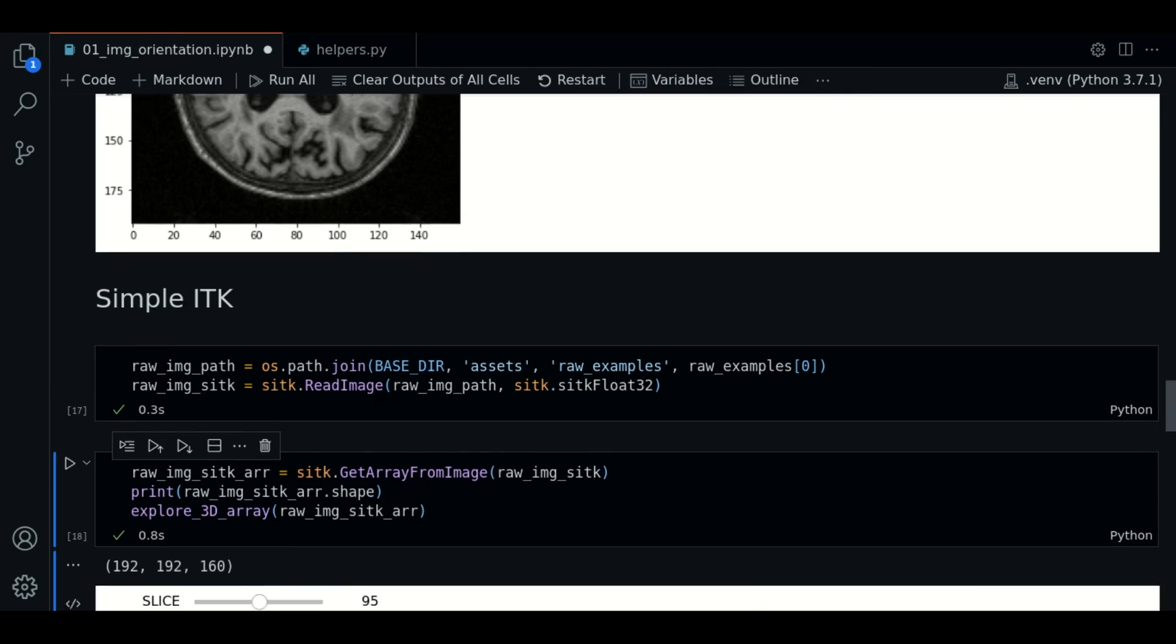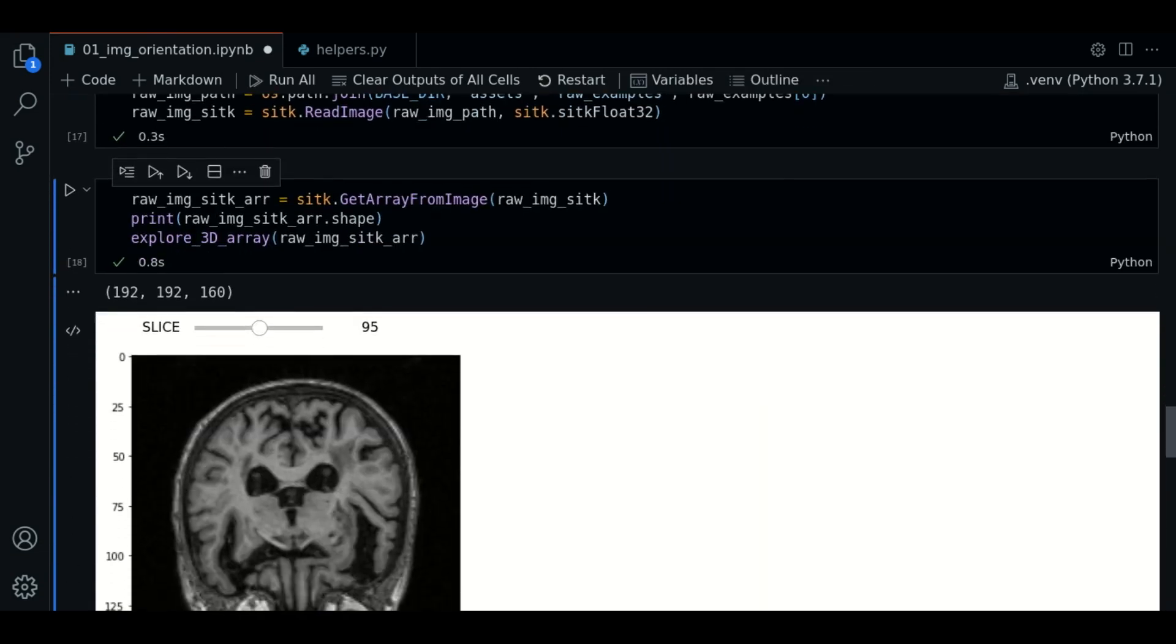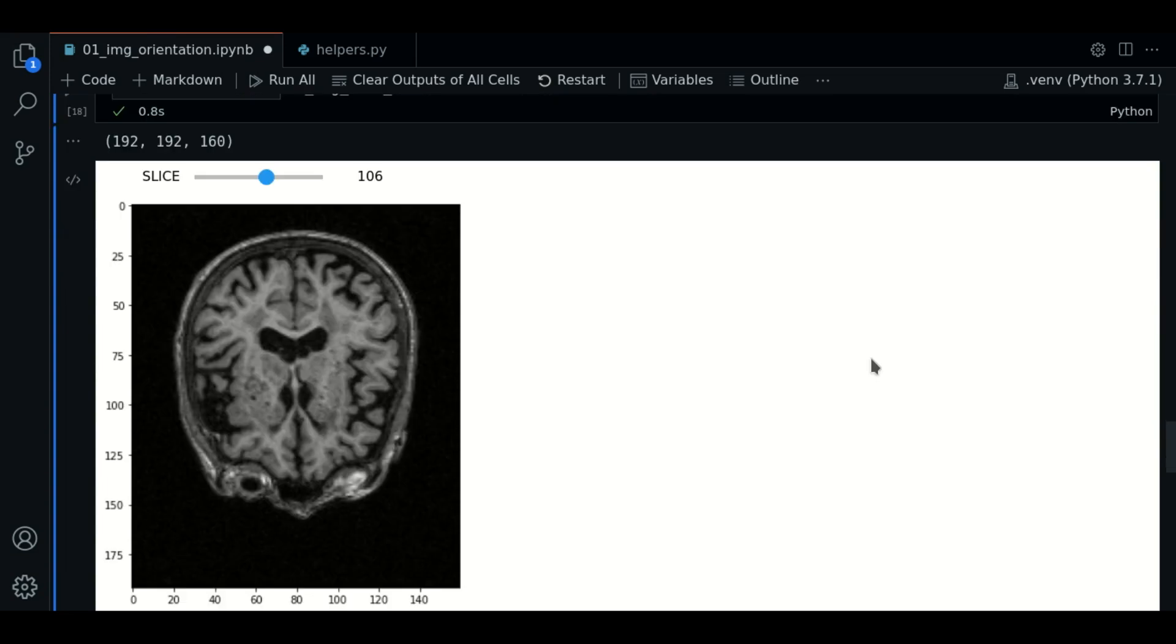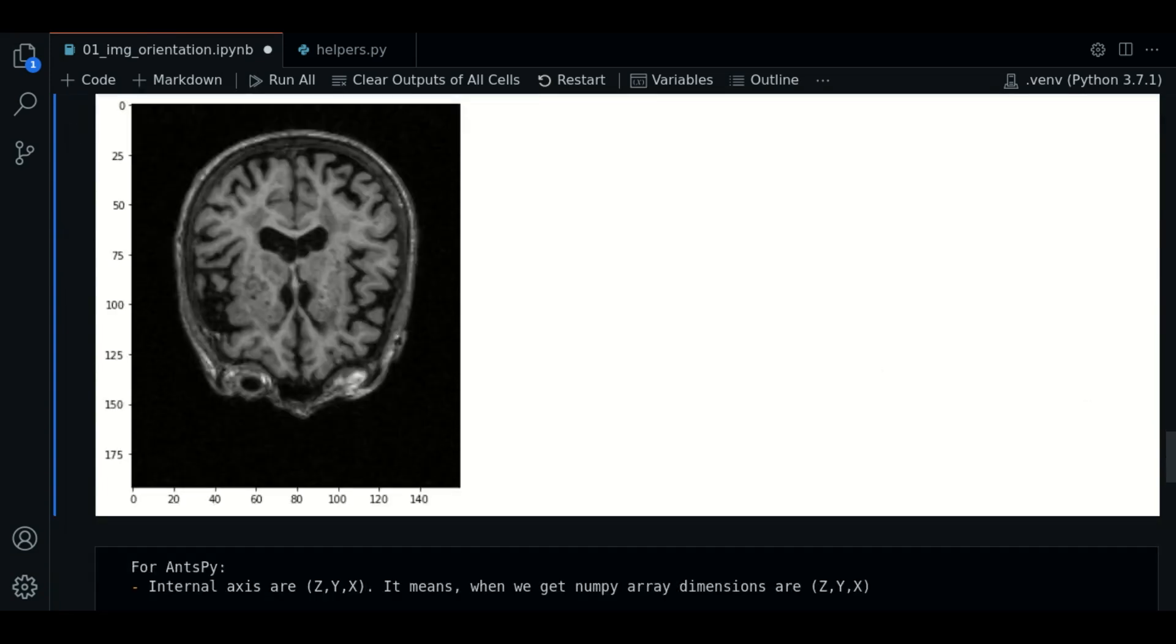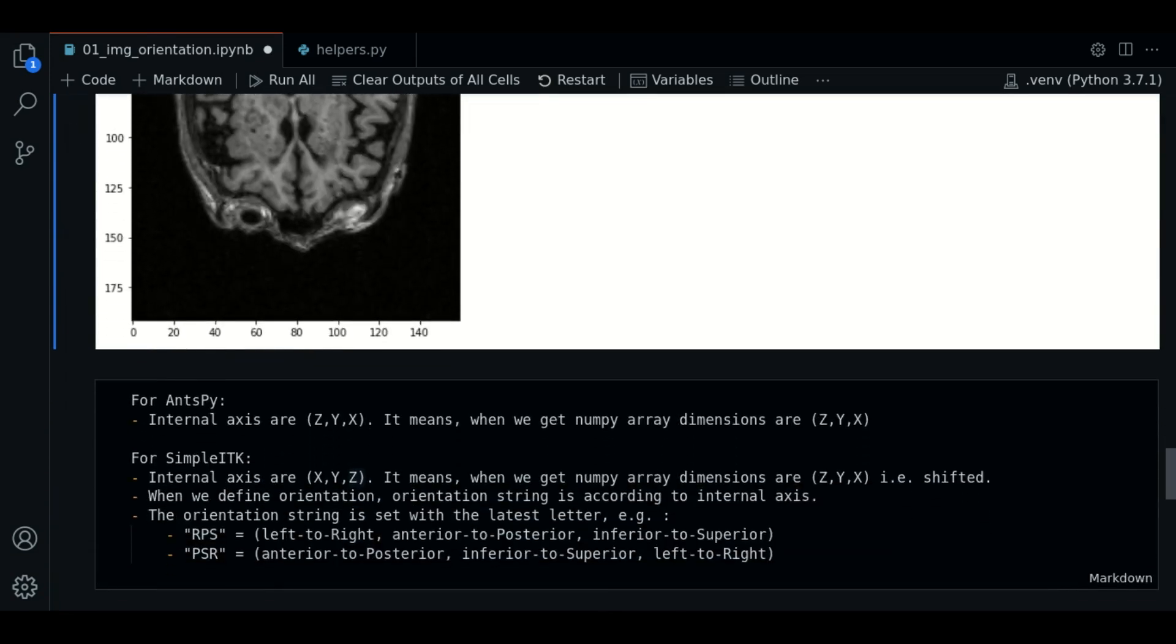This is only to give you a brief view of the default orientation while loading with SITK. At this point, we need to talk about how ANTSPY and SITK handle the numpy arrays internally.